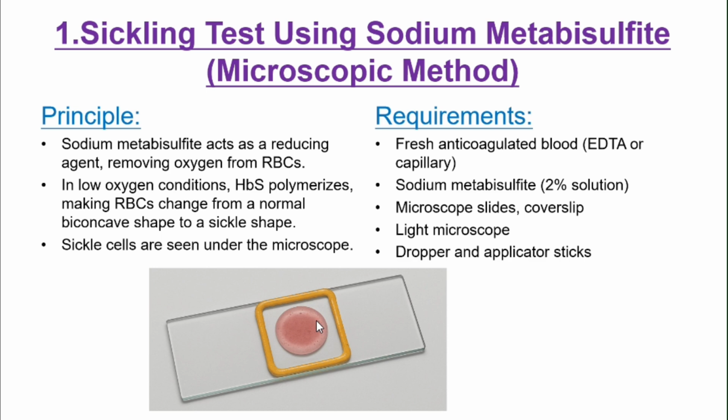Here we are adding a drop of blood along with 2% metabisulfite and mixing it thoroughly with the applicator, adding a cover slip on it and sealing the cover slip with petroleum jelly, leaving it for 1 to 2 hours and then observing under the microscope.